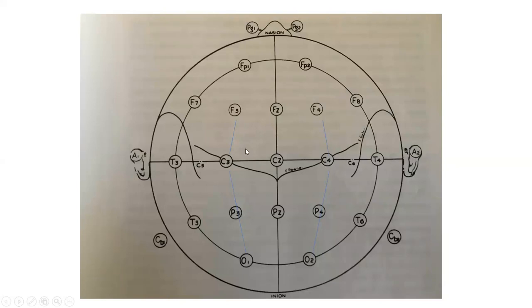So once again, getting back to this concept of time and space, or temporal and spatial summation. So what that spotlight sees, so if you link F3 to the contralateral ear, there's a lot of actual ground that is being shown upon. Whereas if you link the electrodes closer to one another, you're going to resolve the signal a bit better.